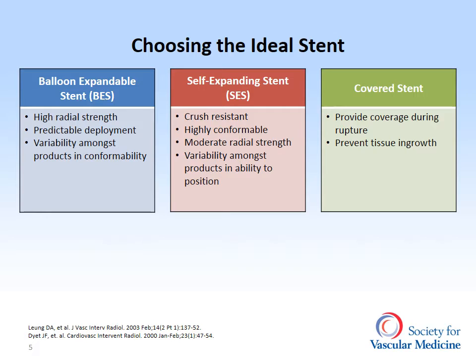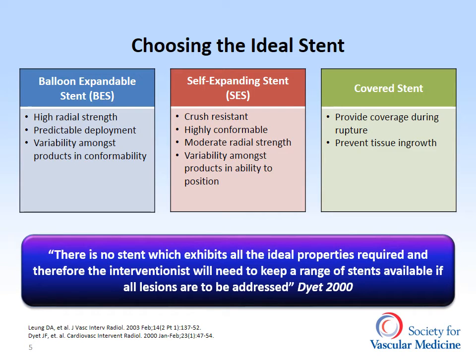Finally, covered stents can provide coverage during rupture and prevent tissue ingrowth. There is no stent which exhibits all the ideal properties required, and therefore interventionalists will need to keep a range of stents available if all lesions are to be addressed.